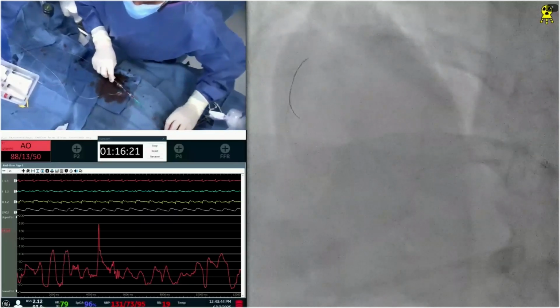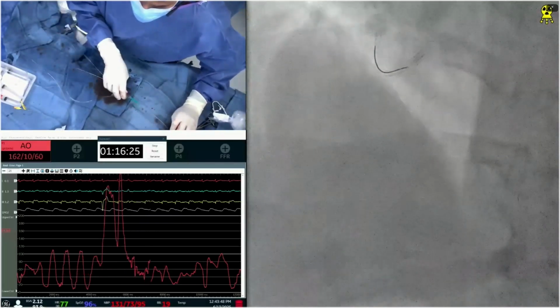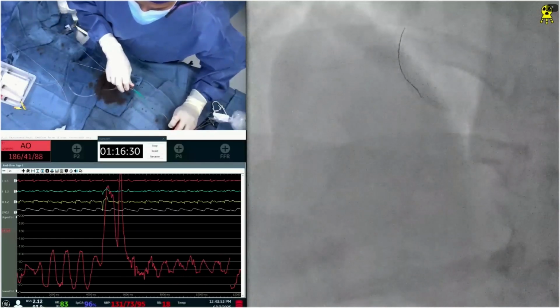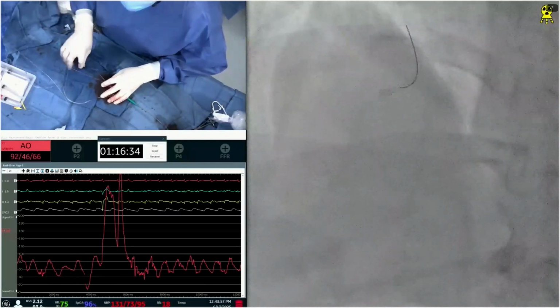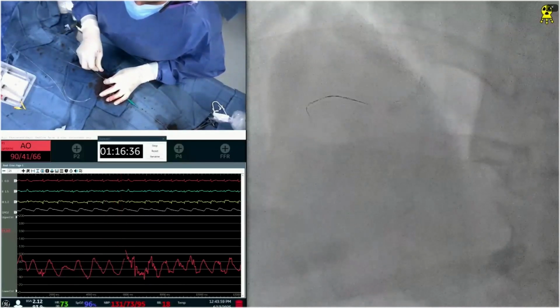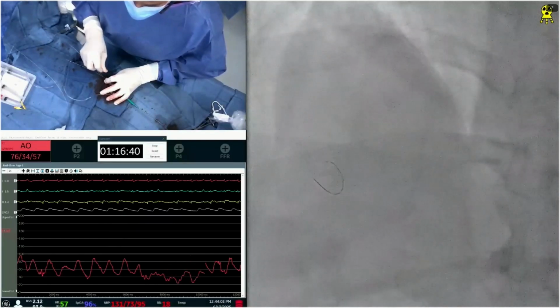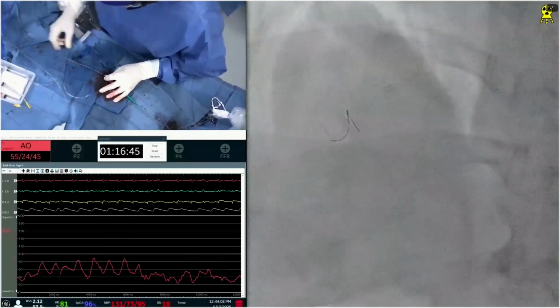No, still the same. Anytime we try to go with that curve, I think maybe we need a new guide wire. Dr. Sharma, so last try, if we still have it, then we have our old AL 0.75, which was the original guide. That's what we decided originally, when we had discussed the case, that we are going to use that.